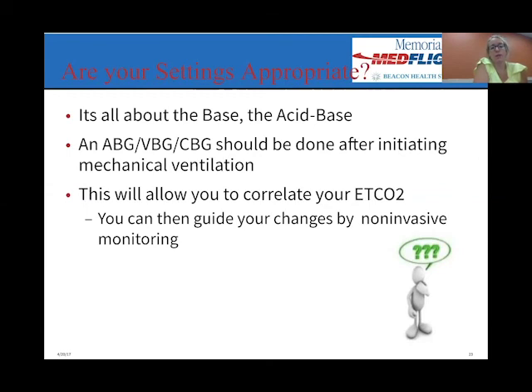But then you're going to look at your acid-base balance, and you're going to correlate your end-tidal CO2, because you aren't going to get a gas every 10 or 15 minutes. How do you know what you need to change on your ventilator? Well, if you correlate your end-tidal CO2 with your PCO2 when you draw it, you'll know what kind of changes you need to make, and you can monitor that through your end-tidal CO2.